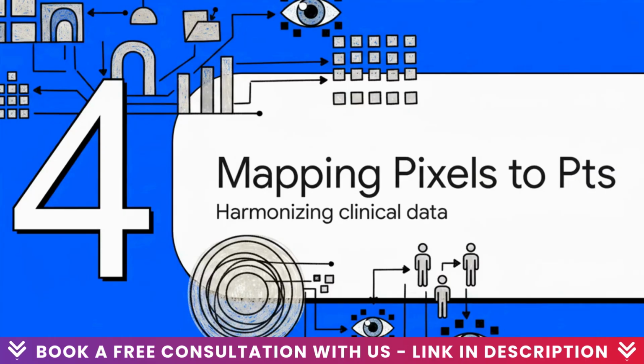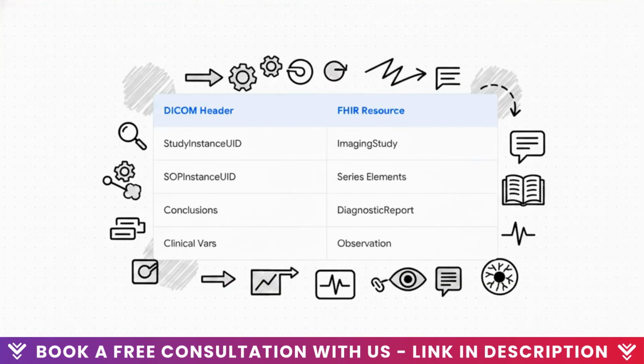Okay, part 4, mapping pixels to patients. So getting the architecture spun up is really only half the battle. We have to actively harmonize the data itself. And this specific mapping strategy is an absolute goldmine for developers. It tells you exactly how to translate those cryptic DICOM header fields into pristine FHIR resources. For example, your DICOM Study Instance UID maps cleanly to the FHIR ImagingStudy identifier. The structured conclusions from the scan map to a DiagnosticReport using SNOMED CT. And your clinical variables become FHIR Observations linked to LOINC codes. This translation layer is exactly how we bridge the gap.